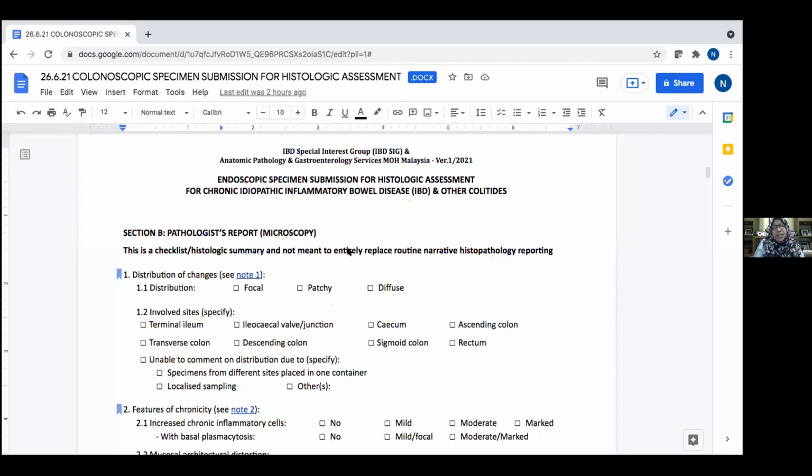In immunotherapy, or in some immunodrugs therapy, you can see a lot of crypt apoptosis in the setting of this. In that setting, when you see a lot, you may not see much, just increase in crypt apoptosis or crypt apoptotic abscess.